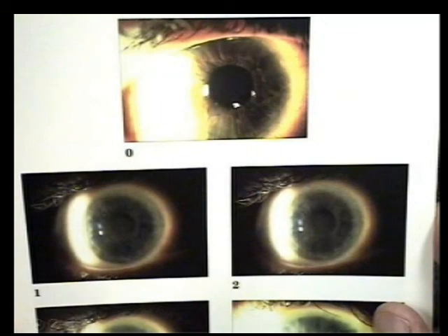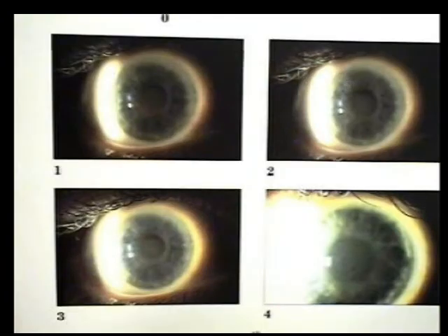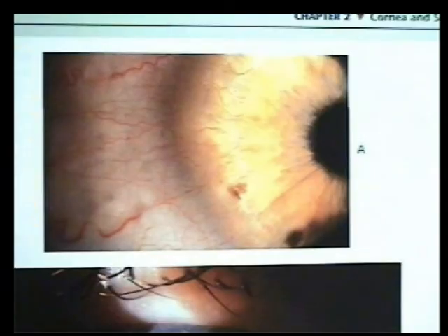You can see the pupils nice and black and clear. But look at number one. We've got a little bit of haze here, and even more prominent in number two. All right, that's corneal swelling. That's edema. And you can see how that swelling, due to a lack of oxygen, will create a loss of transparency. And look at 3 and 4, you can see it's even more pronounced.